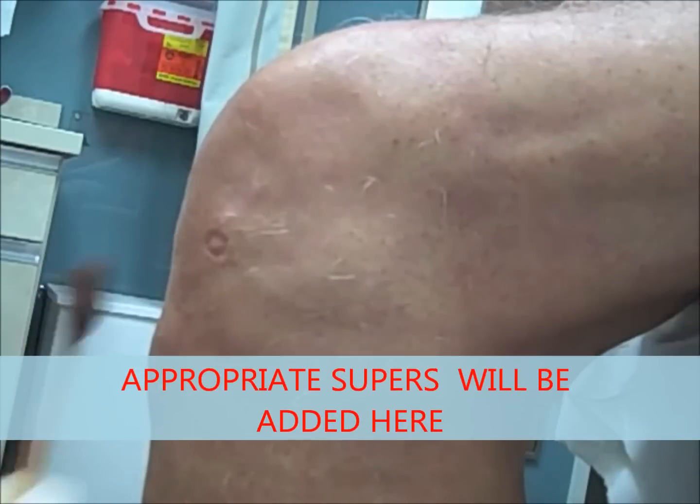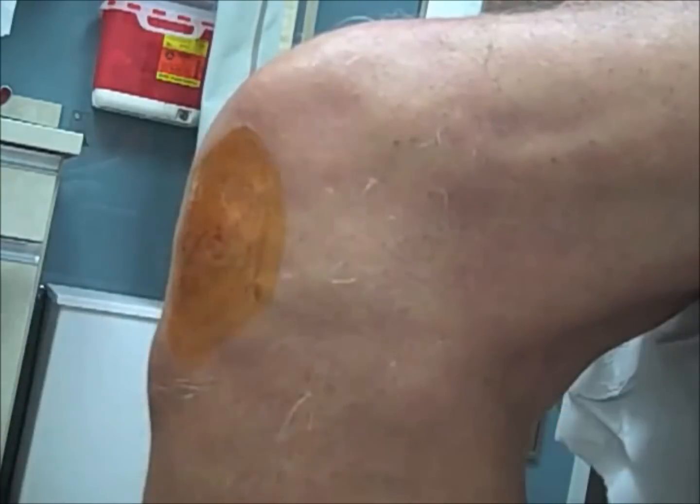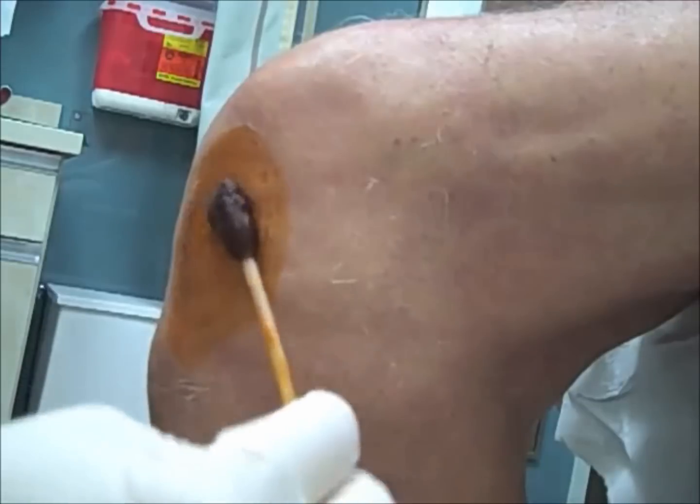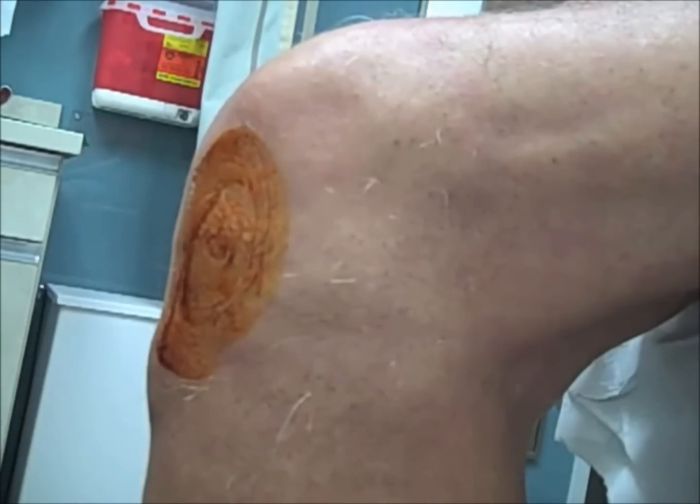At this point, with the skin marked, we'll prep the skin, and we typically will use betadine and or alcohol to clean the skin. The medications that we're going to be using today will be, again, a visco supplement.